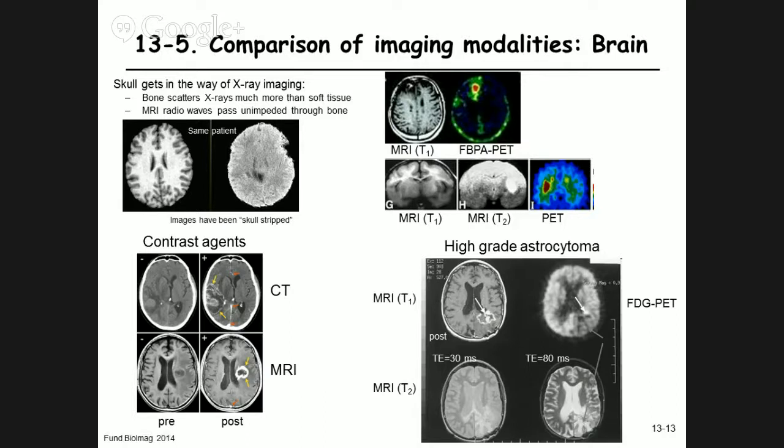So what one can see is there is still a tumor there. Most of the neoplastic tissue, that is the cancer cells, are here. They're not inside here, so that's the surprising part of the PET scan. There is in this image destruction of the tissue, so part of it is necrosis. But typical with a tumor, there's also edema, and in edema there's a change in water content and therefore T2. So these are the events that are here.